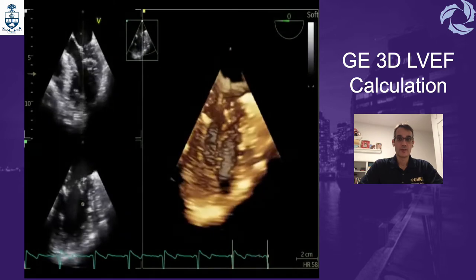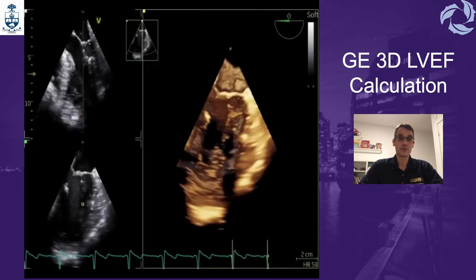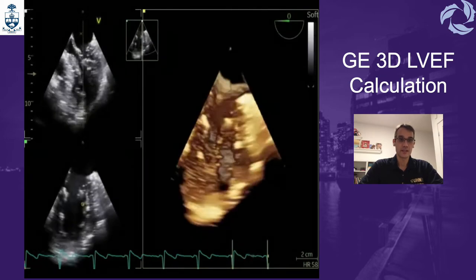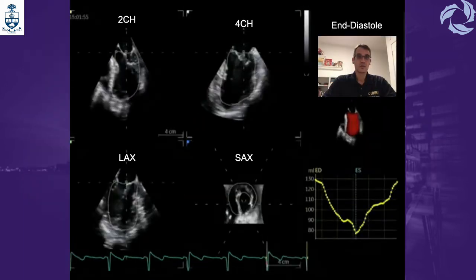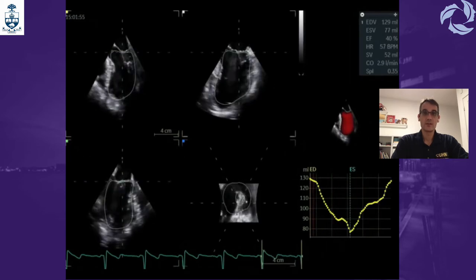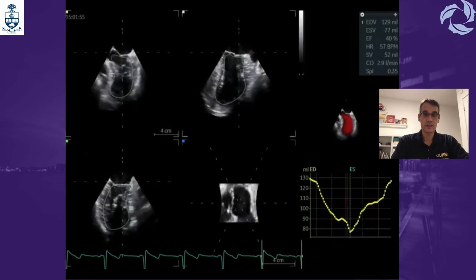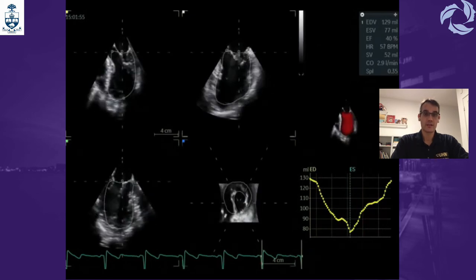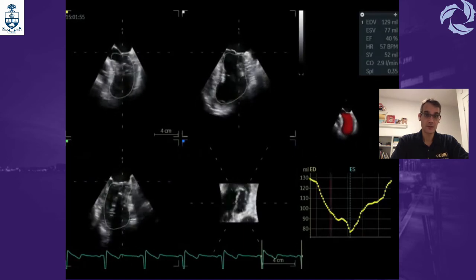To calculate the 3D left ventricle ejection fraction with the Vivid, acquire a 3D dataset and use the Vivid software to position reference points following the instructions — first in end-diastole from the two-chamber, four-chamber, long axis, and short axis views, and then in end-systole. Once the reference points are positioned in both frames, the software generates the output image from which you can obtain LV ejection fraction, stroke volume, and cardiac output.